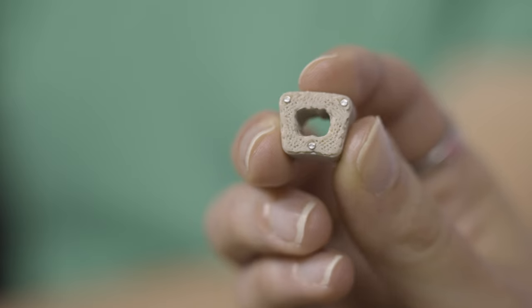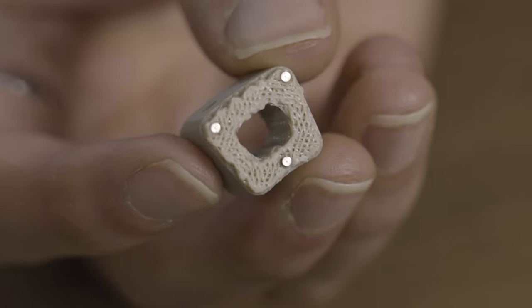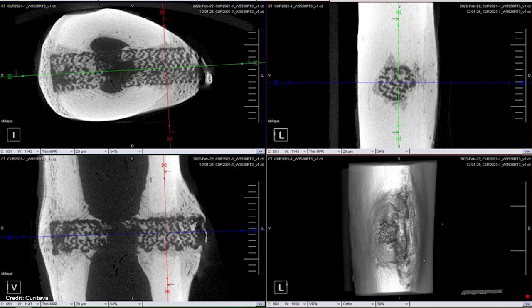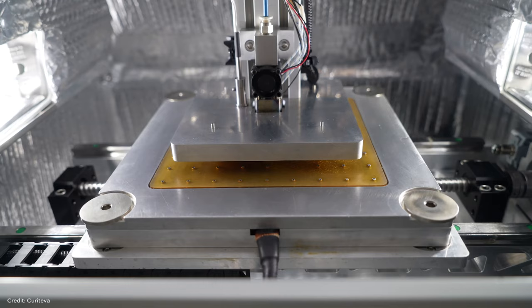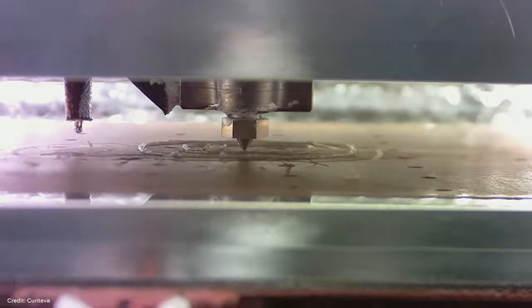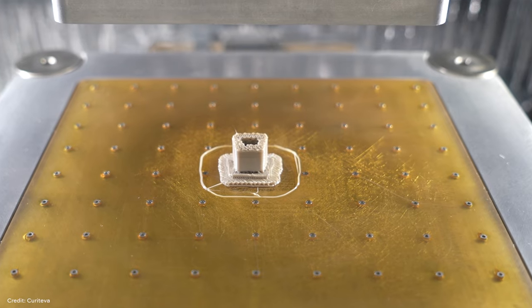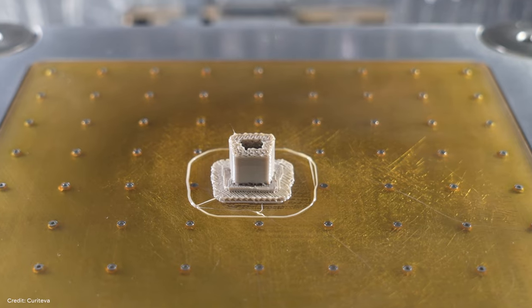All right. 3D printed spine implant made of PEEK. PEEK is valuable because of its stiffness, matching human bone, and also because of its invisibility to X-ray. This is a cervical spine implant made by Curiteva. They use a process called fused strand deposition, which is similar to FFF, except that you are actually stretching the material as you're depositing it, pulling these taffy strands and creating the geometry of these parts.